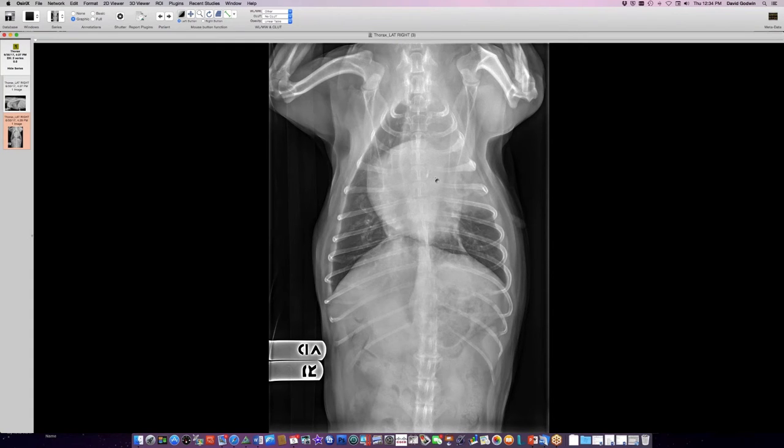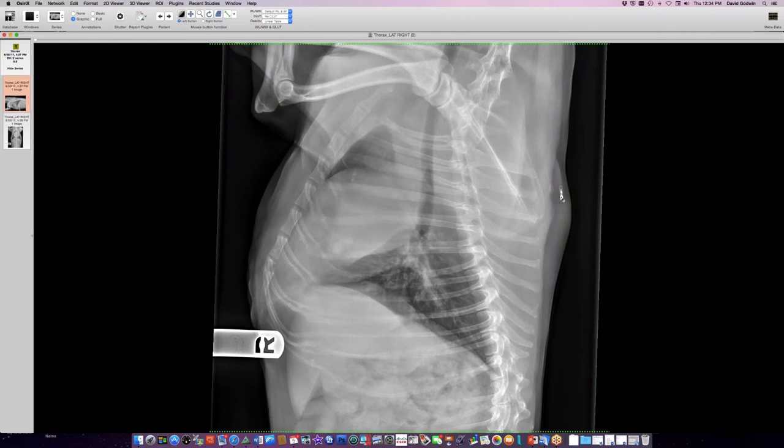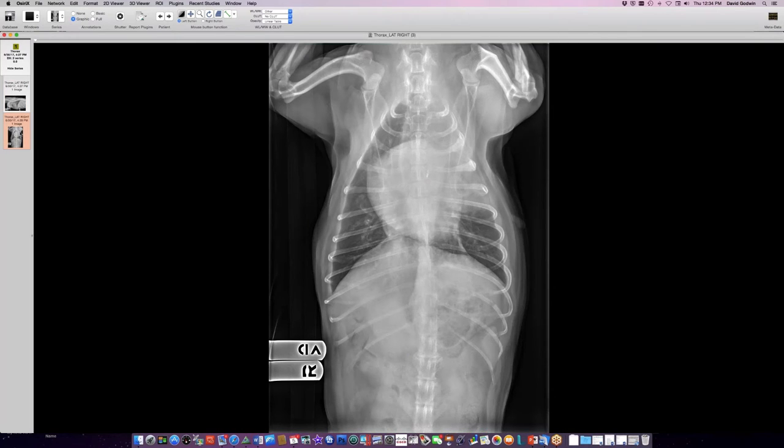When I was shown this case with the left upper lung consolidation and this little device here, I thought this might be an aspiration, but it turns out that this is the chip that identifies most dogs, and the chip is implanted here. So this was not an obstructing foreign body associated with the airway. This was a subcutaneous identification chip for this dog. This dog was owned by friends of one of my colleagues here at work, so I was asked to look at the chest radiographs. My first canine case in a long time.